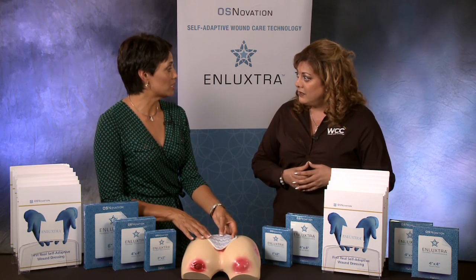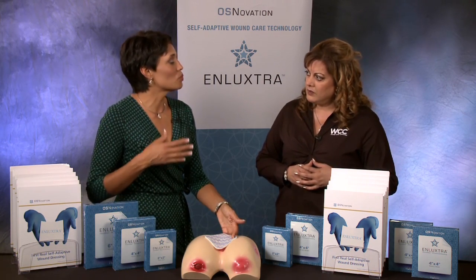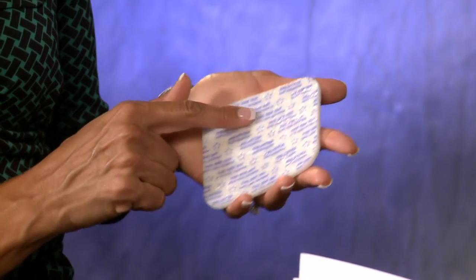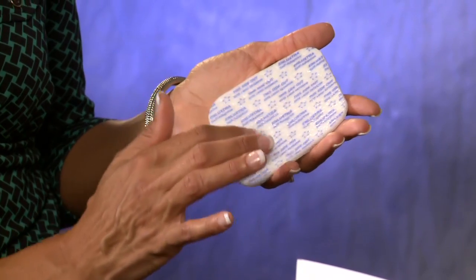The longer you use this dressing, the more days you'll be able to step out your patients with this particular dressing. By the third and fourth dressing change, you'll see that the wound has flattened out, the edges are level with the wound bed, and you start to see the inflammatory cycle respond. When you have a wound, you want to allow for a proper reservoir of dressing around the wound.